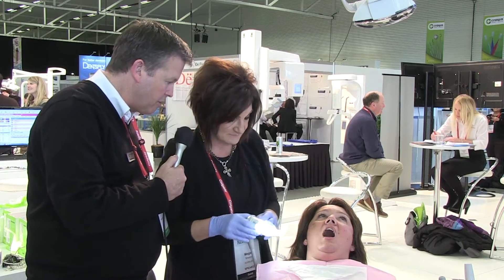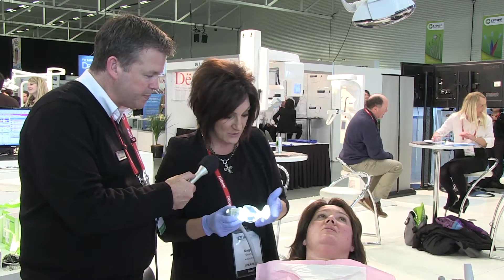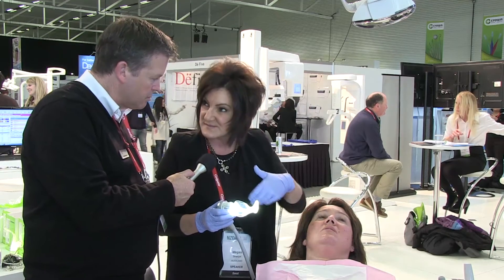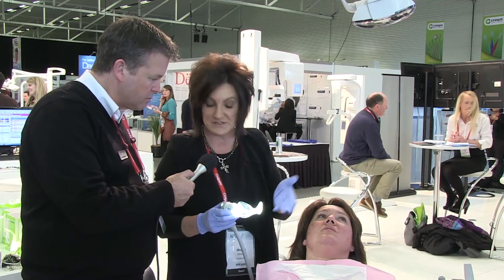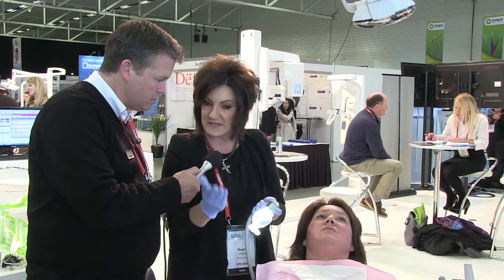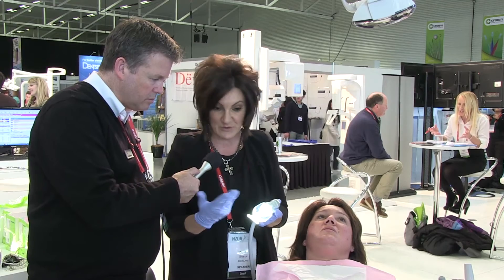She's probably more medium? Yes, she's a medium, so I'm quite happy to fit a medium into her mouth. We've just put a little bit of lubricant onto Kelly's lips so that the insertion is smoother for the patient. The lubricant that comes with the kit is fundamentally just a normal aqueous-based body lubricant.